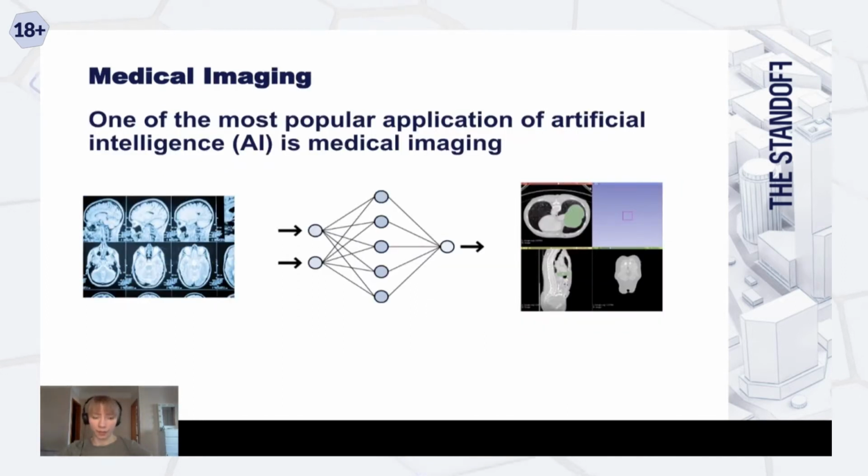Okay, why medical imaging? You might have heard that medical imaging is one of the popular trends these days, where neural networks are used for the classification of medical studies. And these medical studies are stored in the DICOM format.